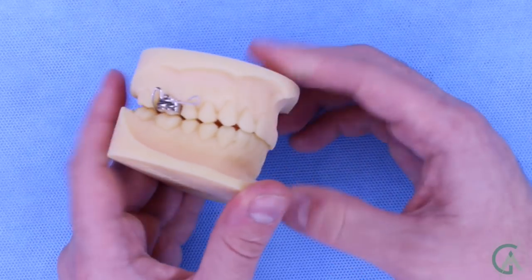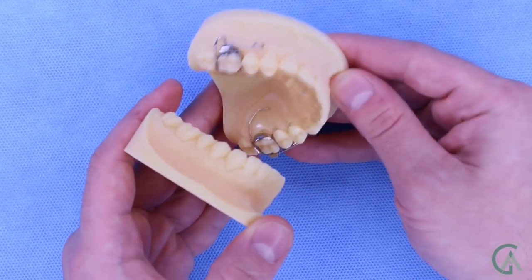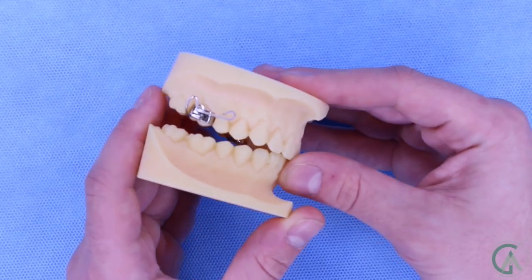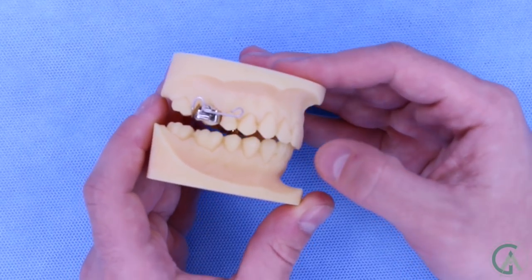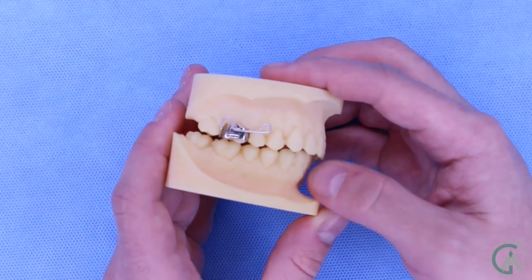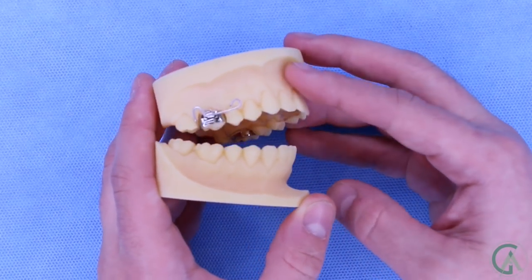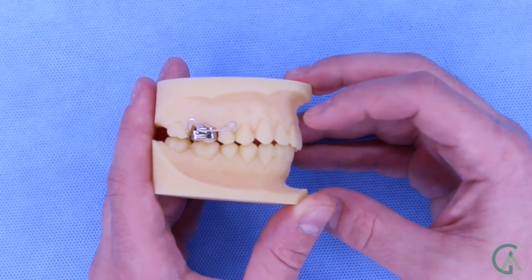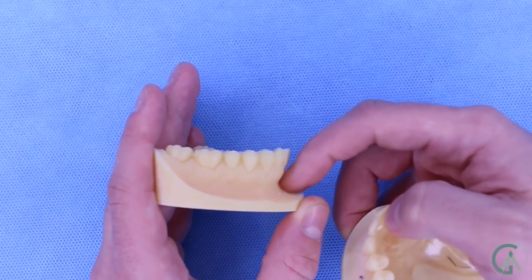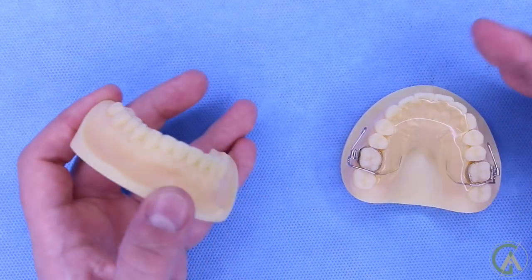If you had a deep bite, your lower teeth would be covered up by your upper teeth. But when you have this bite plate in, what's going to happen is that your lower teeth will hit the acrylic — just like this — and there will be a constant force. Whenever you're chewing, it'll be pushing your lower teeth down and getting rid of your deep bite. Every time you bite down or put your teeth together, these lower teeth are receiving a force downward, which causes them to intrude and make your deep bite less deep.